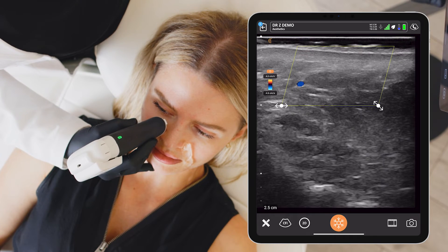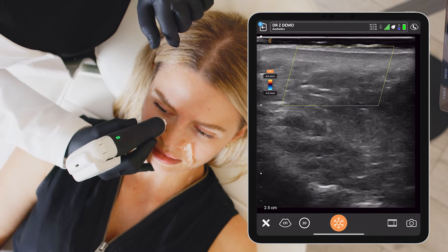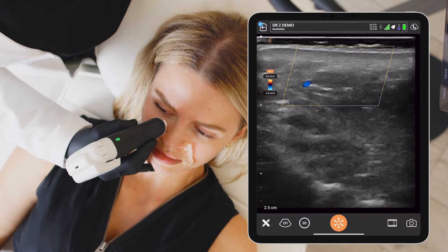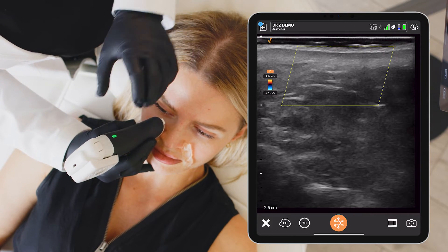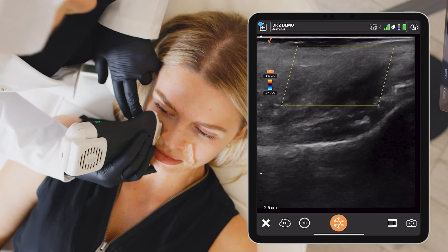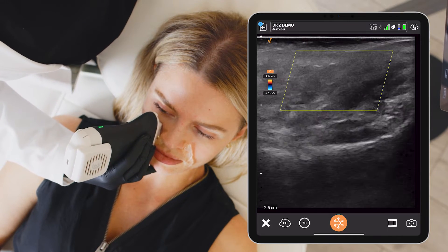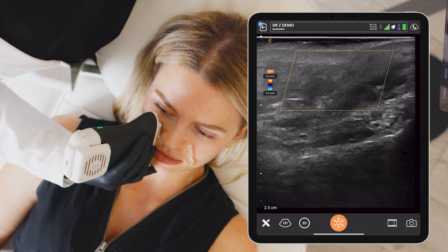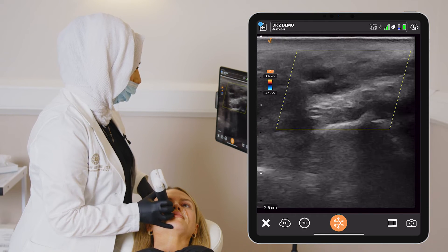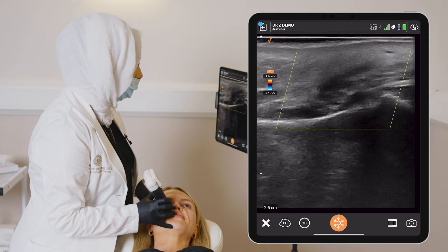So we can see the skin, we can see the hypodermis, the superficial fatty layer. We can see a vessel there, likely to be the angular artery. The angulations will change quite a bit as I scan this area. I've increased the size of the color box to allow me to look for vessels within the various layers of the tissues here.